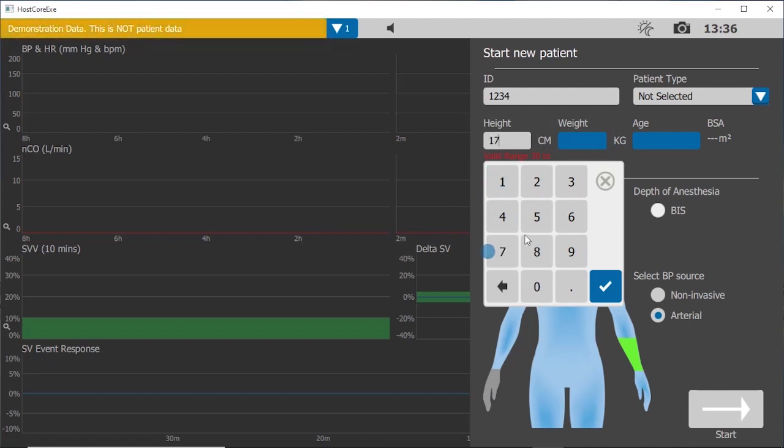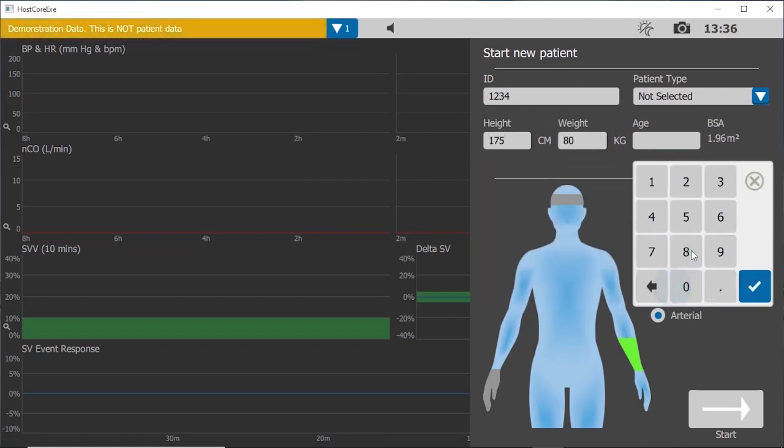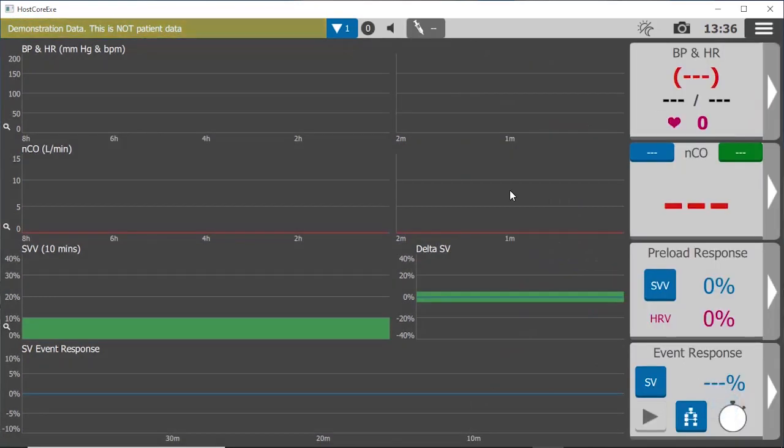Then height, weight, age, and the patient type will populate automatically. Notice the default BP source is arterial, so just press the blue start icon.